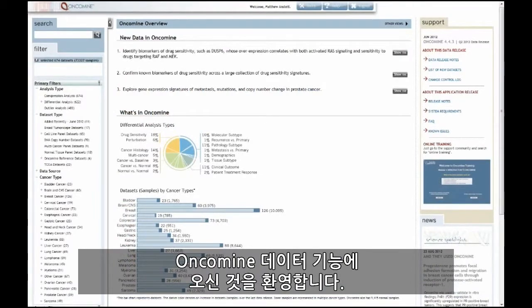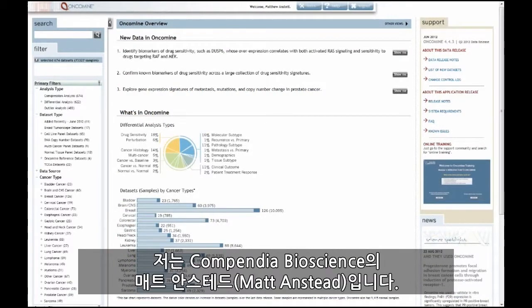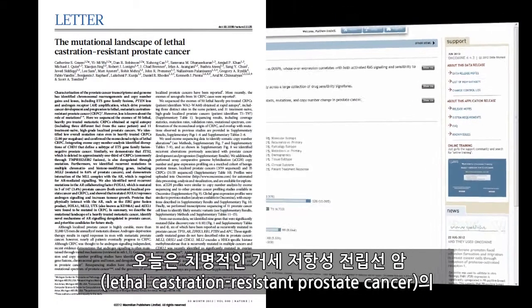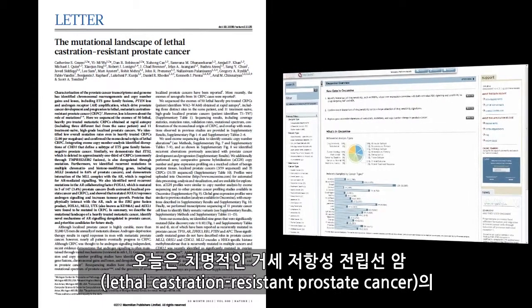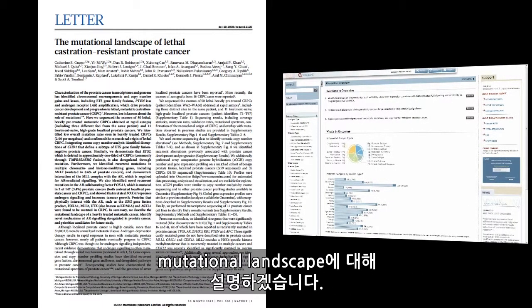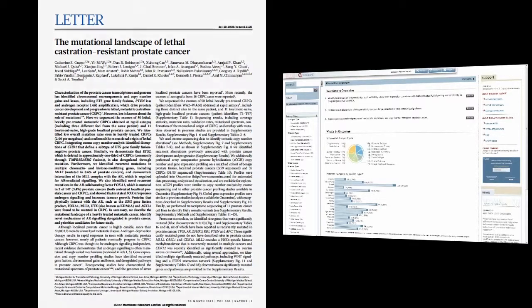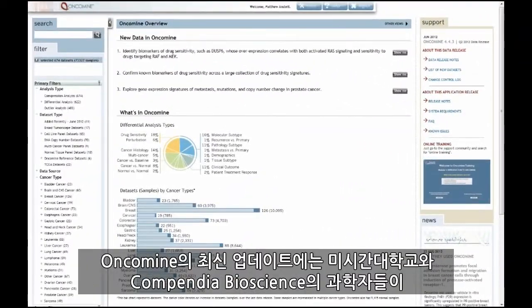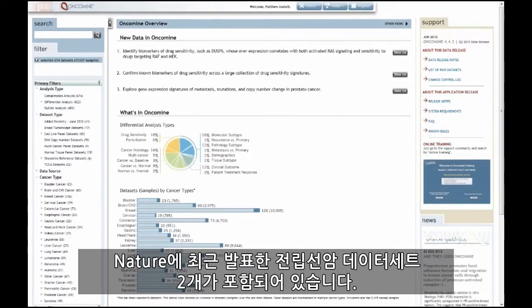Welcome to the Oncomine Data Feature. I'm Matt Anstet from Compendia Bioscience, and today I'll be presenting the Prostate Cancer Mutational Landscape in Lethal Castration Resistant Prostate Cancer. The latest update to Oncomine includes two prostate cancer datasets recently published in Nature by scientists from the University of Michigan and Compendia Bioscience.